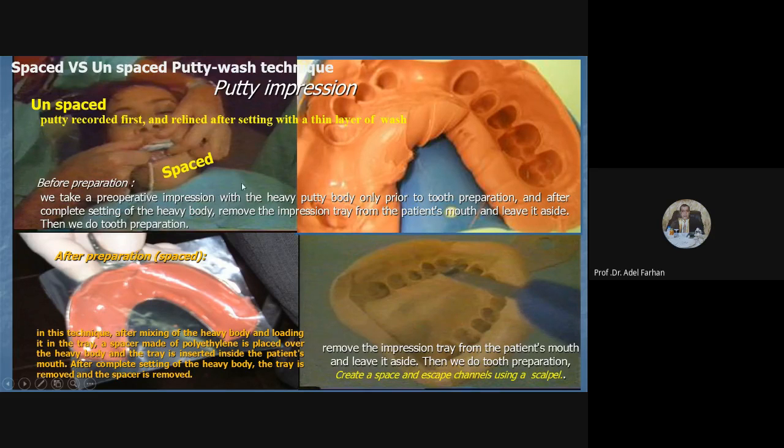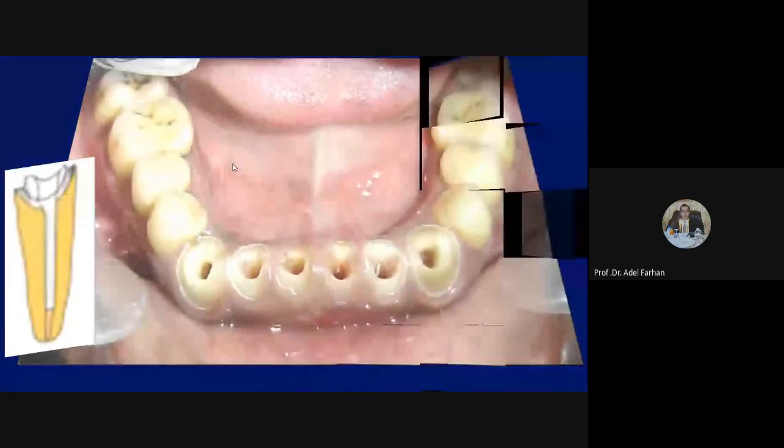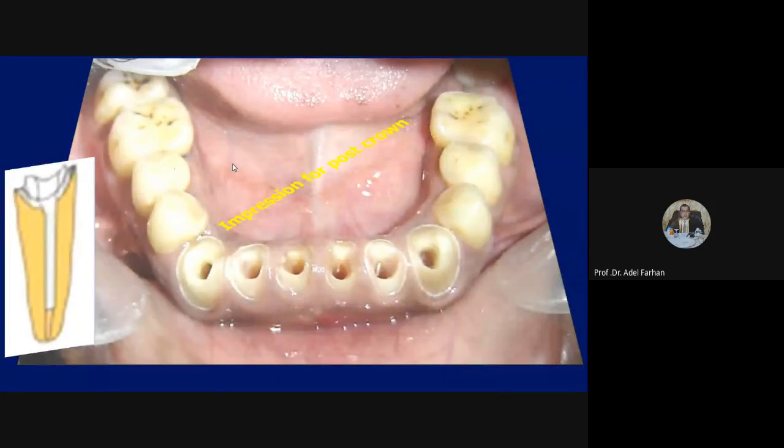والطريقه الثانيه ما يحتاج سبيس نسوي، تاخذ الهيفي اوكي بعد ما يصير الهيفي سيتنج تطلع الهيفي امبريشن، بعدين تسوي الميكسنج. هيفي باتي سوري، بعد ما تسوي باتي امبريشن تسوي ميكسنج يعني ما نحتاج سبيس. هذه ايضا تكنيك اخرى without any space. طبعا اكو اراء مختلفه حسب you have to create space or not. طبعا شويه اذا امشي اسرع لانه نحتاج اكو افلام اخرى اريد اسويها بس ماكو وقت.